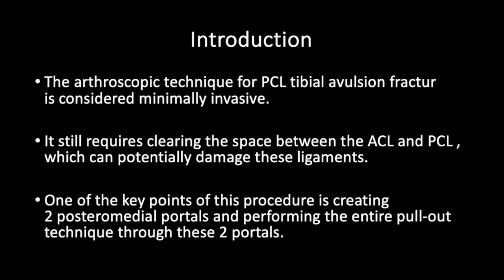Introduction. The currently used arthroscopic technique for PCL tibial avulsion fracture that uses anterior portals and posteromedial portals is considered minimally invasive. However, it still requires cleaning the space between the ACL and PCL to insert arthroscopic instruments, which can potentially damage these ligaments.